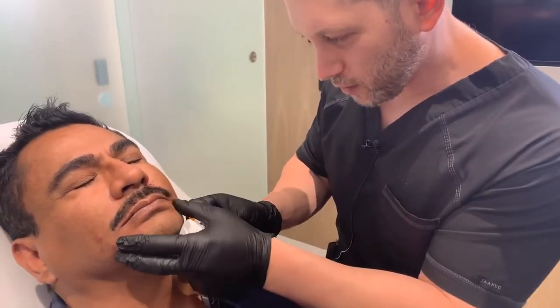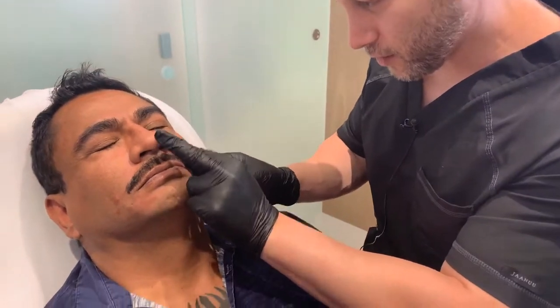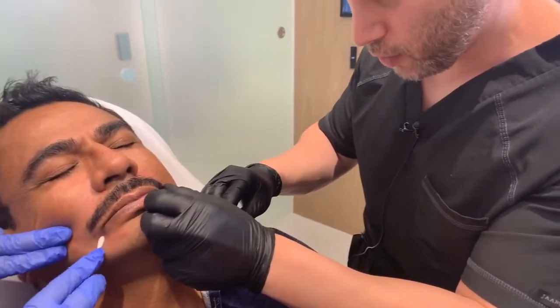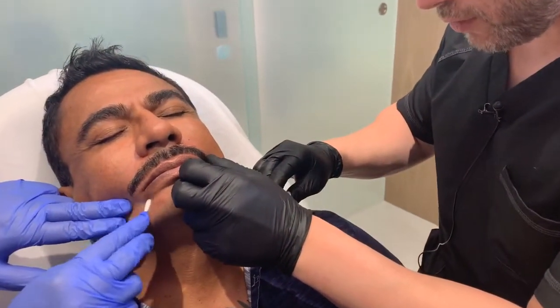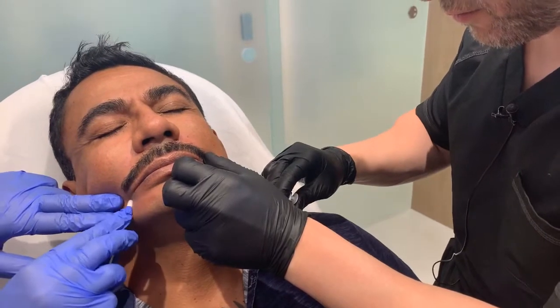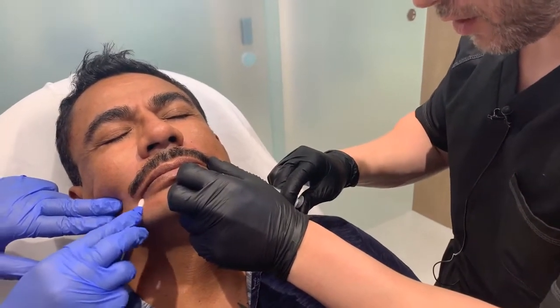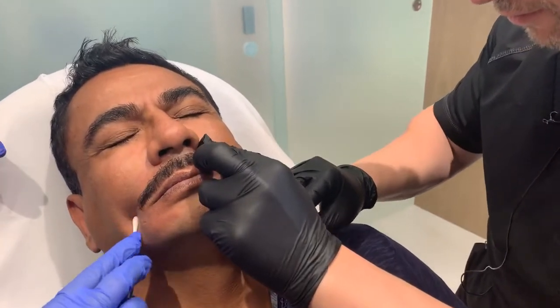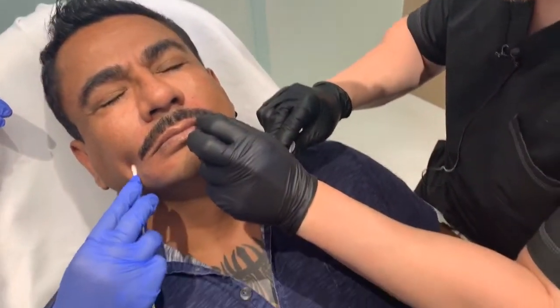And we're going to go right into the fold on this side using the Restylane. And again, giving him some volume, all the way down to the piriform aperture of the mouth. Just going to do a light massage, very light. Okay, we're going to go back. Perfect.